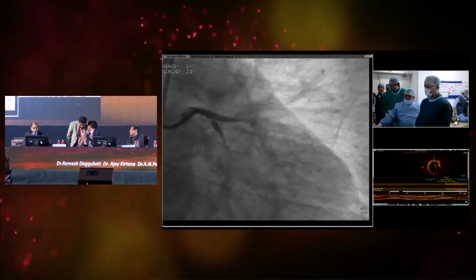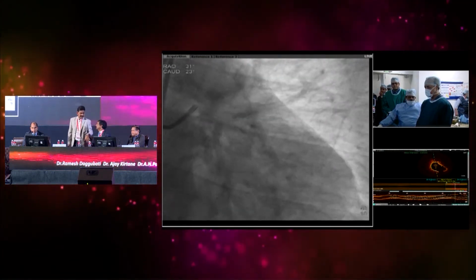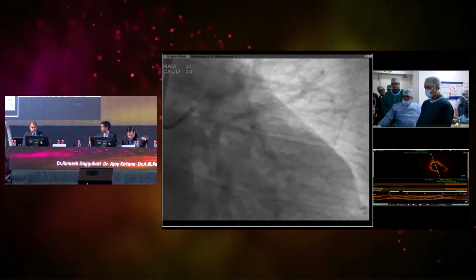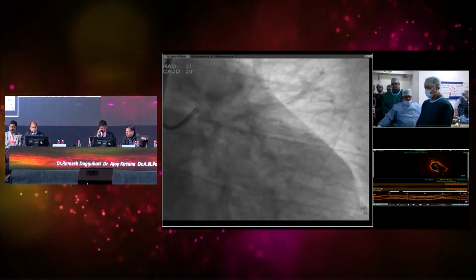No, this looks great. I think it's a very good result. You know, it's a tough case. The patient's diabetic. They already have diffuse neointima in the LAD stent that was put in just a year and a half or 2 years ago. So I think that getting the maximal areas that you can get, which is how you did it, is going to hopefully prevent him from having a restenosis. But this is a great result.